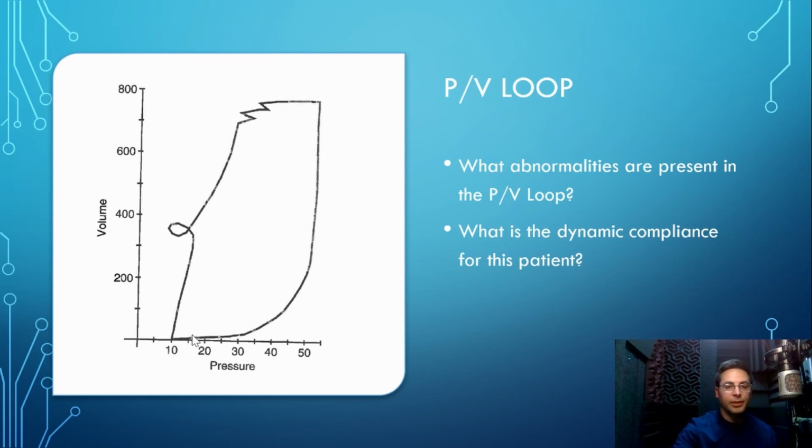There is our typical increase in pressure. We have our lower inflection point rising up to our upper inflection point. We're not seeing any violation of that upper inflection point. But upon exhalation, we're seeing some disturbances and a brief increase in volume and pressure, followed by our return to our baseline of 10, which shouldn't be 10 because our set PEEP is 7. This, to me, is very clearly showing that we're having some sort of patient-vent synchrony issue.